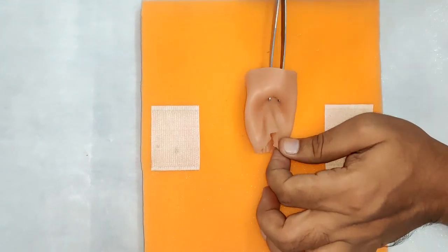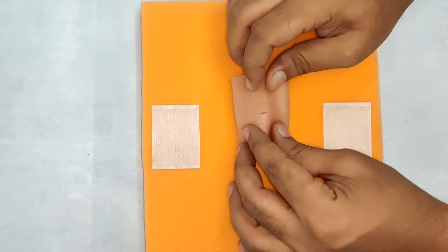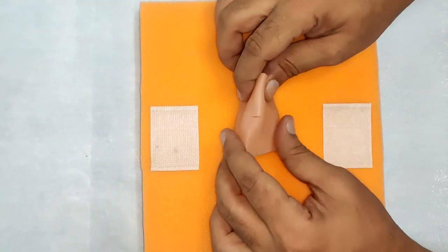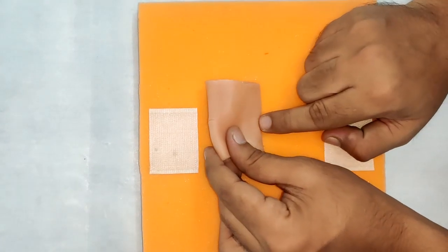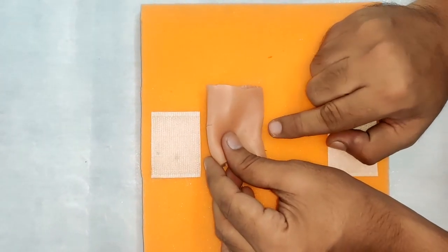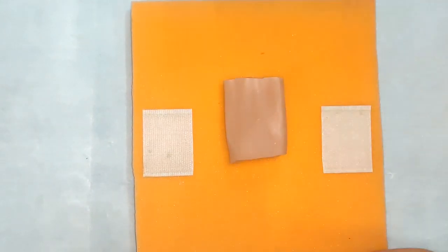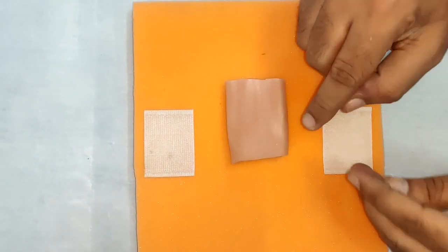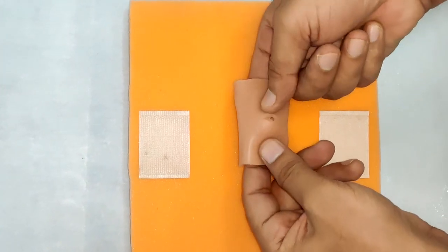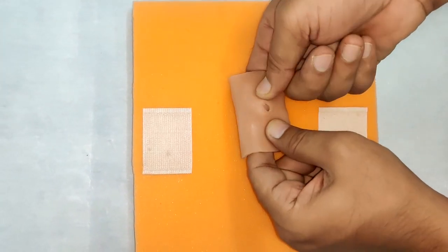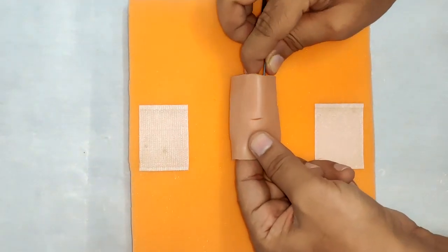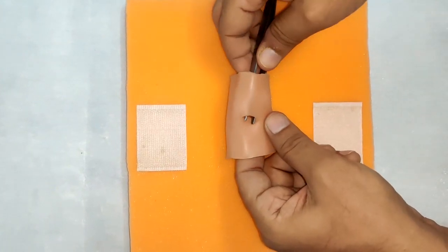Before we start suturing, there are some principles that we have to follow. If the hole is too close to the mesenteric border, we will have to resect and anastomose the two segments. But if it is on the anti-mesenteric border and a small perforation of 0.5 to 1 cm, we will go for primary closure of the perforation.